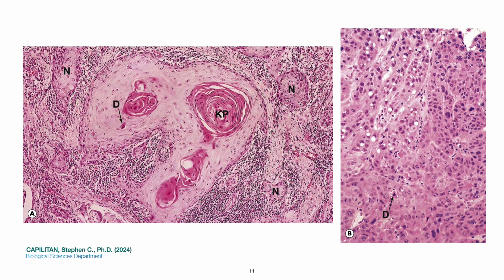This is squamous cell carcinoma. In letter A, it is well differentiated in high power, and B is poorly differentiated in high power. Squamous cell carcinoma may arise in any site of native stratified squamous epithelium, for example, your skin, your esophagus, or your tongue. They may also arise in stratified squamous epithelium that is formed by the process of metaplasia, for example, in the bronchus or urinary bladder.